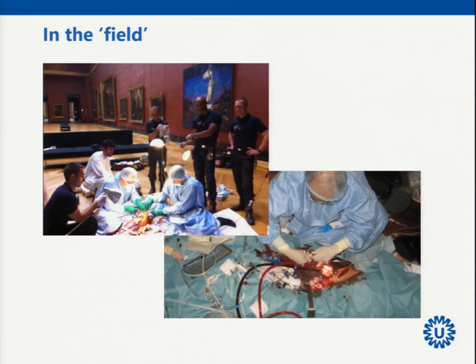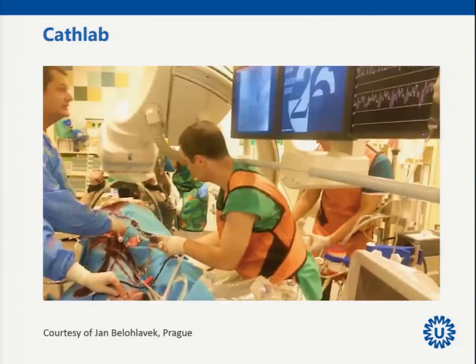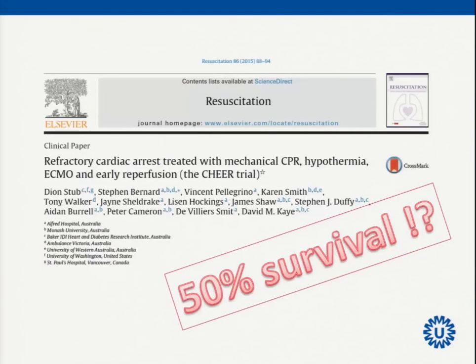And some people find this a little funny. And you see this if these slides come up in presentations on large congresses. So then you will see that the audience will discuss whether this is really a good idea. So I don't know if this is really a good idea. This is Jan Belohlavek in Prague, who has set up an out-of-hospital resuscitation study with ECMO, and he has not yet published the data, but what I understand, and that is something which we understand from all the trials that are ongoing, that survival is not really convincing so far.